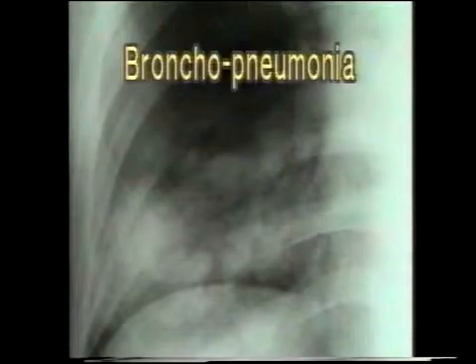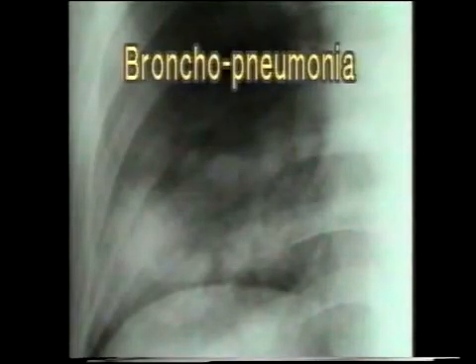Note the fairly large patches of consolidation, much larger than the miliary tubercles seen in miliary tuberculosis.